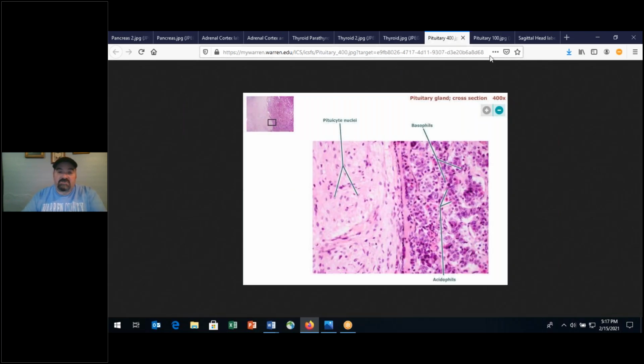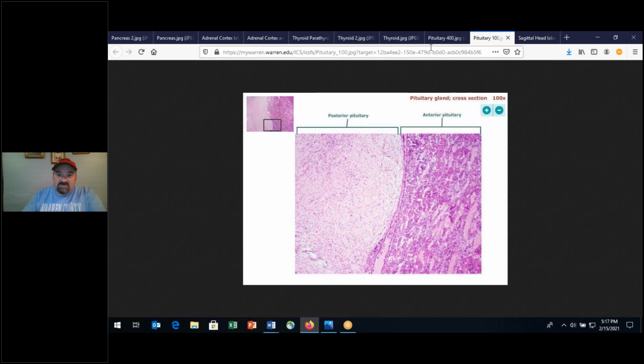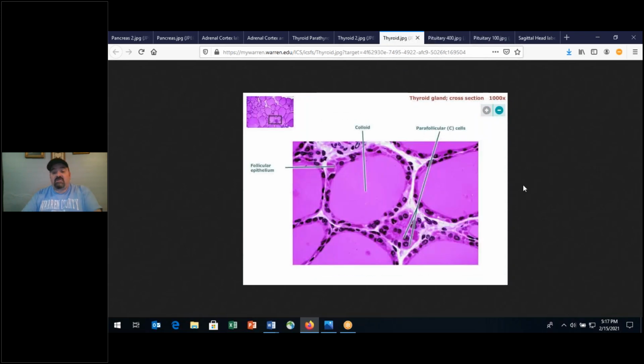So that's pituitary tissue, okay? The pituitary gland, folks, is what we would consider the master gland. The hypothalamus would be considered the master controller of the pituitary gland, because it really has ultimate control over autonomic function. As we are going to be in the autonomic nervous system on Wednesday, know that it transitions well into the endocrine system as far as that hypothalamic control over what's taking place in the endocrine system, including the release of hormones.